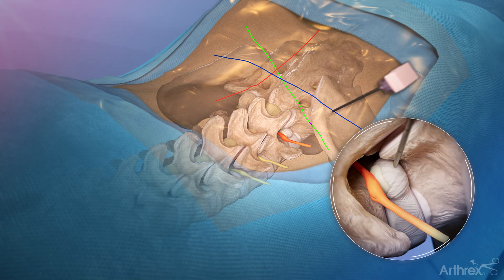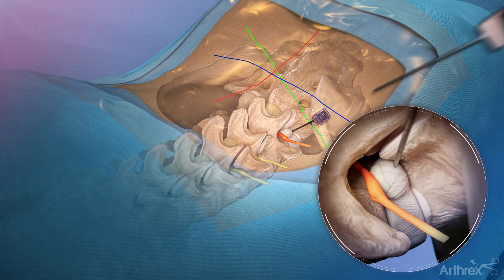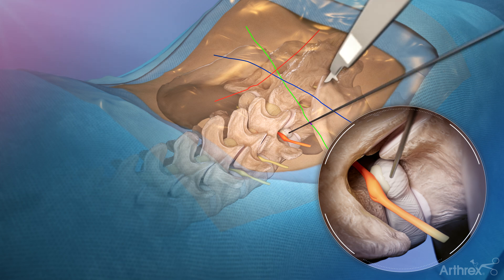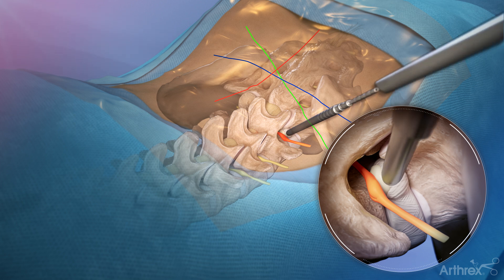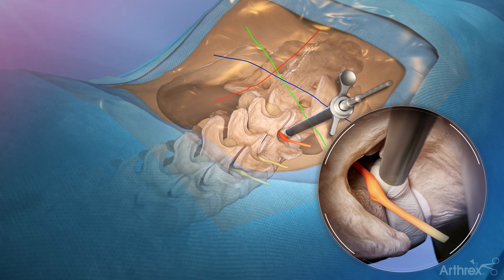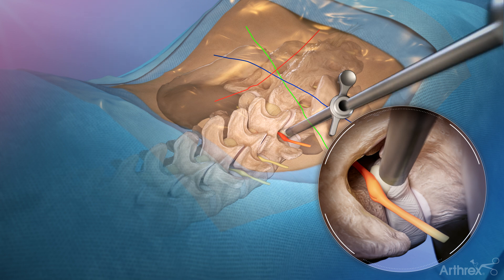Insert an introducer needle while utilizing AP and lateral imaging to ensure the needle avoids neural structures. Remove the stylet and place a guide wire. Use a scalpel to make an incision to accommodate the outer diameter of the dilators and cannula. Sequentially place dilators over the guide wire. Place the cannula with the orientation of the cannula opening toward the exiting nerve root.